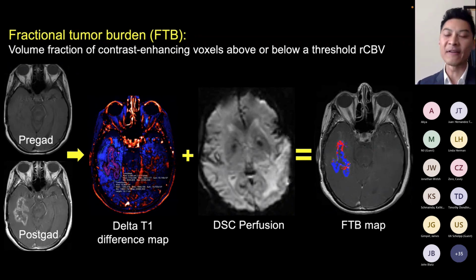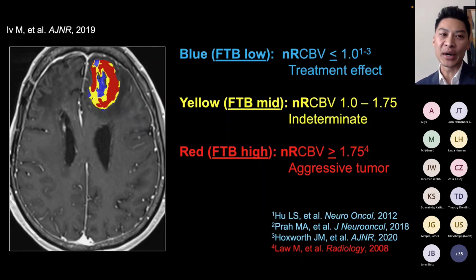And that's kind of a simplified concept of what is happening here. Now, which thresholds are we using? Well, we set to use 2 different thresholds, and the use of 2 thresholds really builds in a gray window, which is this yellow area, this indeterminate area where you're not quite sure what's happening because there's overlap.